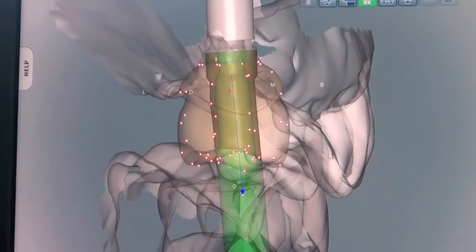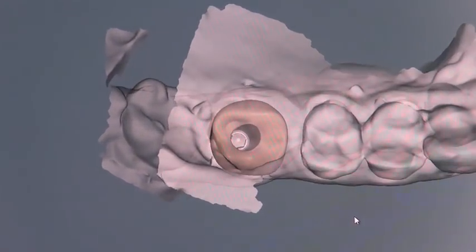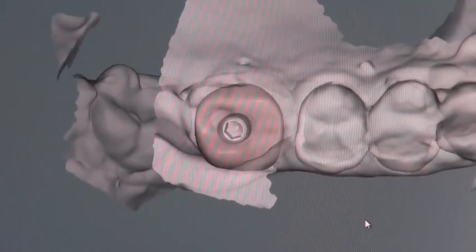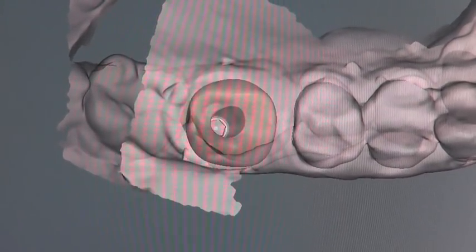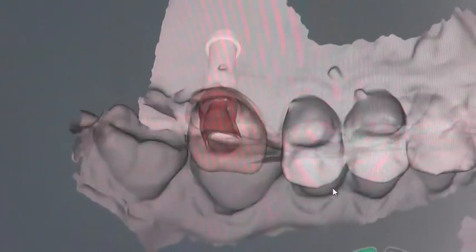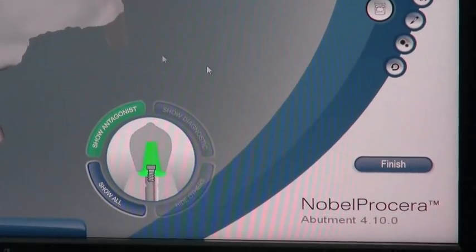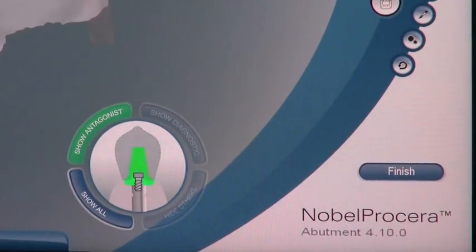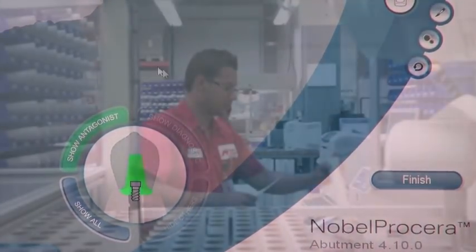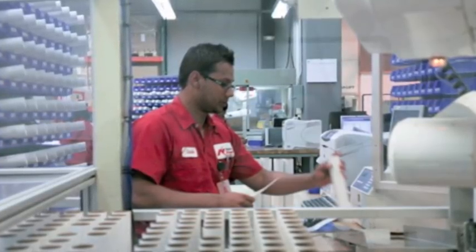The screw channel is now pointed at the buccal cusp of the lower molar. Now we can have our final look at the abutment and envision the porcelain that's going to be added on the outside to make it into a screw-retained crown. Once we have this all finished we click the finish button and this will send it off to Nobel Biocare to one of their facilities for milling, where they use very sophisticated equipment to mill this very precisely.